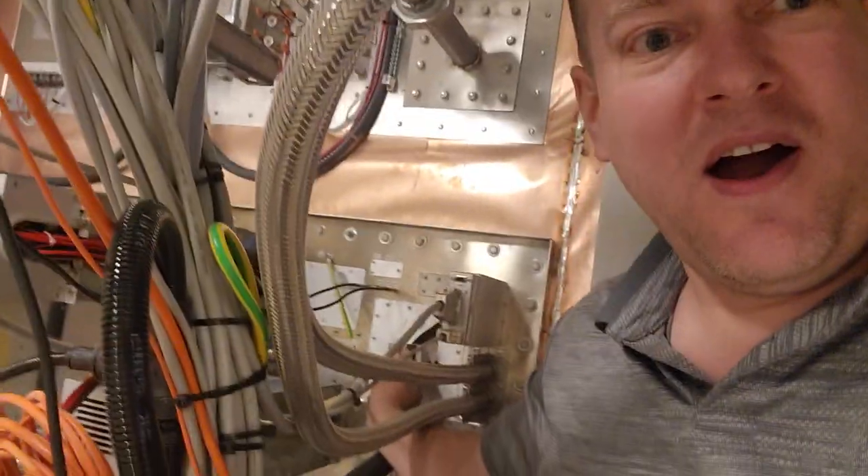Hey everyone! Welcome back to Better Biomed. Today we are suspended on top of a giant cabinet and we are installing panel components in an MRI suite.